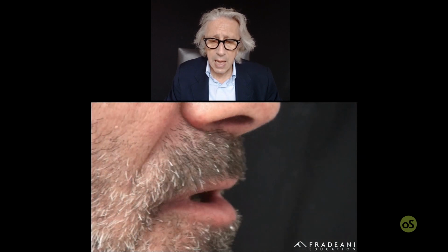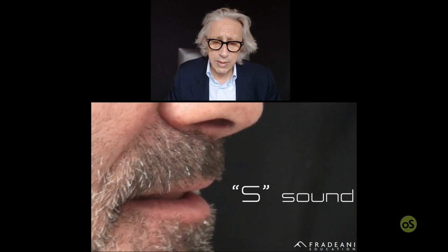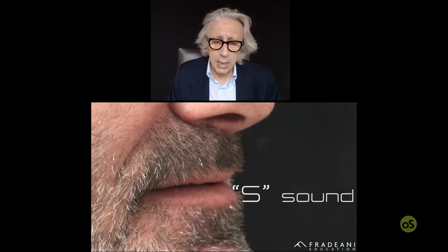And the S sound, as you know, is very important for two reasons: to determine the VDO and to check the VDO when you increase it, but that's not the case at this point yet. But another important role is to see if you have a retruded or anteriorized position when you say the S sound, like 66, 67, or like Mississippi. As you can see from this S sound, it seems to be quite vertical, so the mandible is not going more in front. So you can elongate the teeth without any problem.